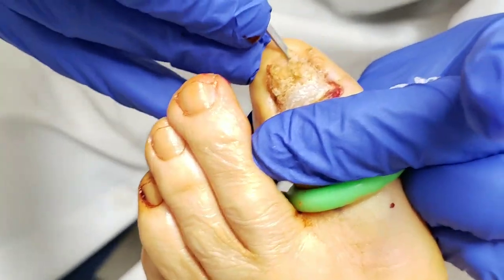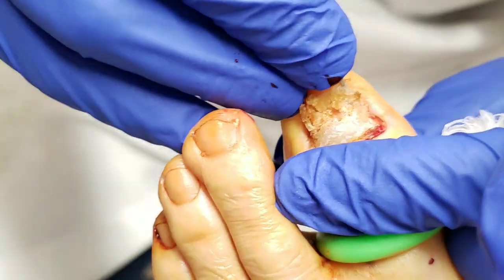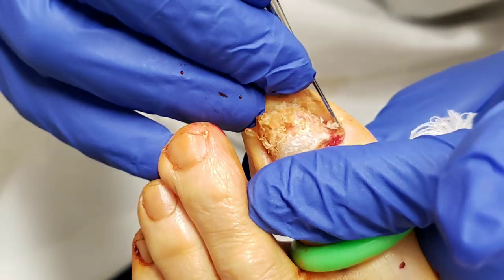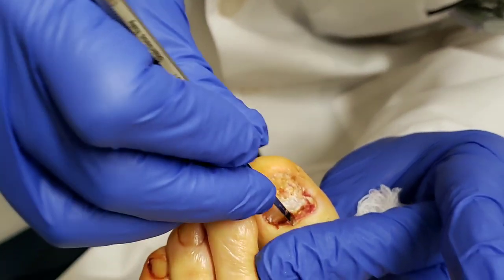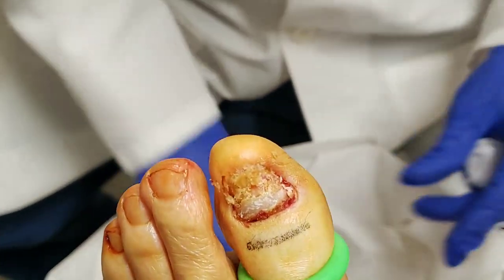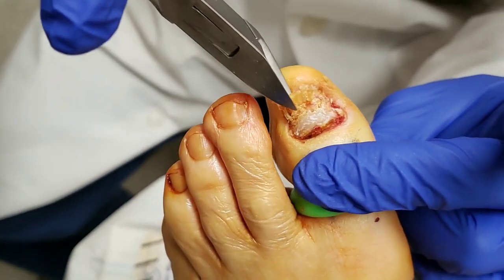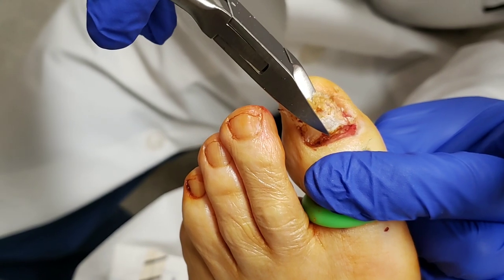And you can see this goes under this other layer of nail, so this is going underneath it. So that was one layer and this will be the other layer. I find that it doesn't stick as much if you free it up around the edges. So around the edge of the nail, if you free it up, it makes it a little bit easier. Then this other layer of nail, I go right underneath it in the same way — I just kind of free it up.